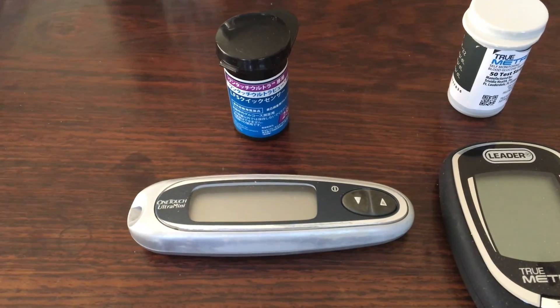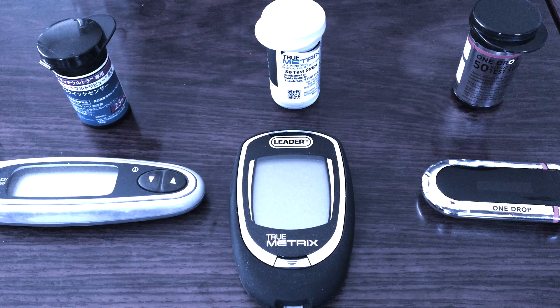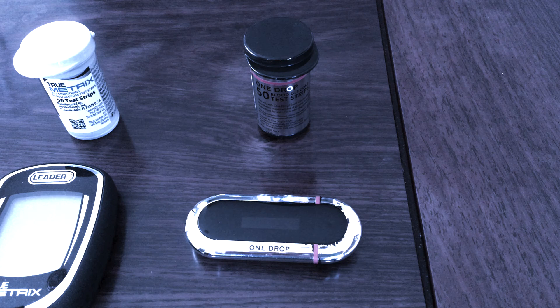Here are the contenders: a OneTouch Ultra Mini, which I bought 12 years ago; a TrueMetrics, which I bought three months ago as an emergency backup; and my OneDrop, which I've had for two years and is my main meter.